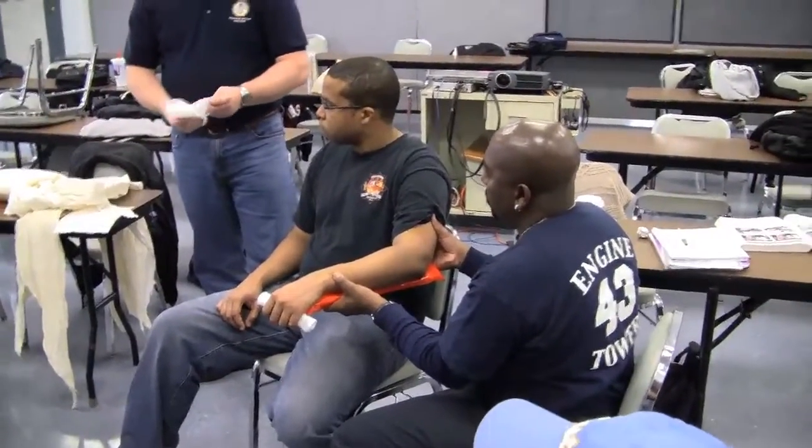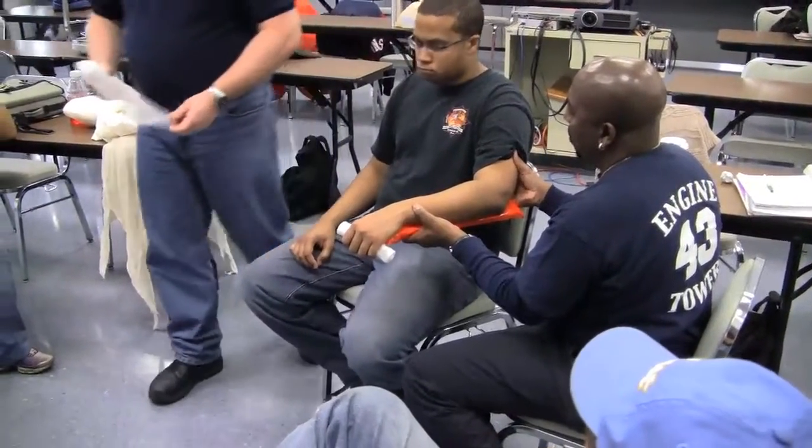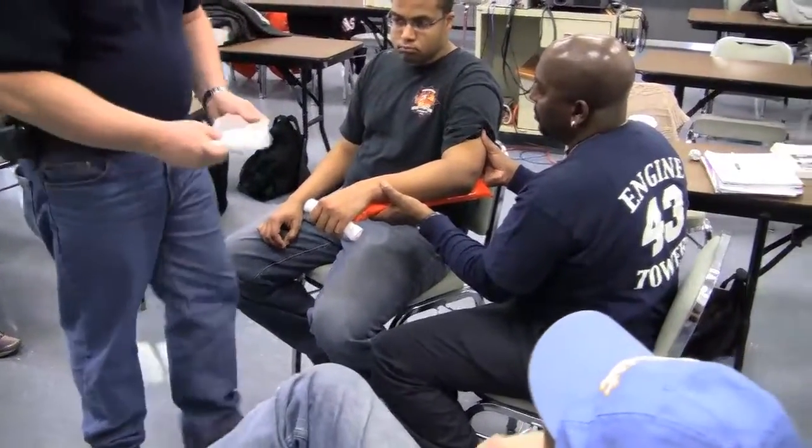We're going to use a kling. This kling is awful. This is awful stuff.